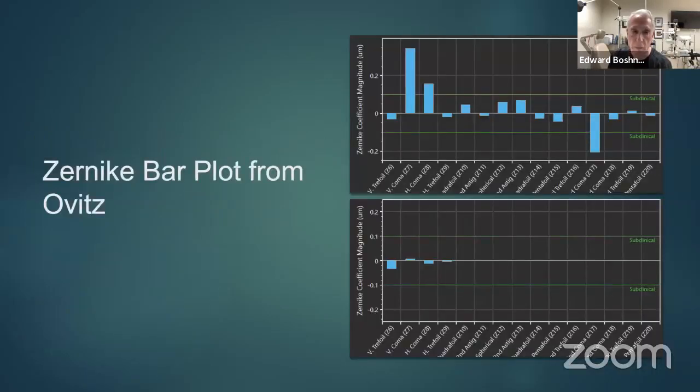And this shows the before and after, where we do the imaging before we have the Zernike images, before we have the HOA's technology embedded in the lens, before and after. You can see the difference.